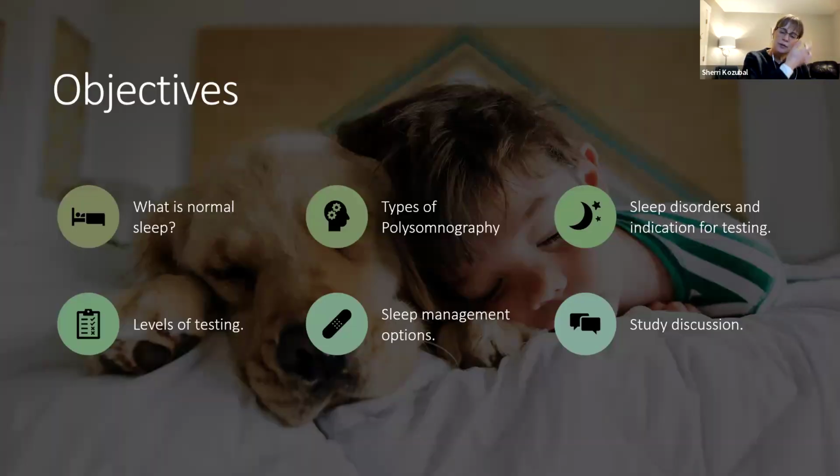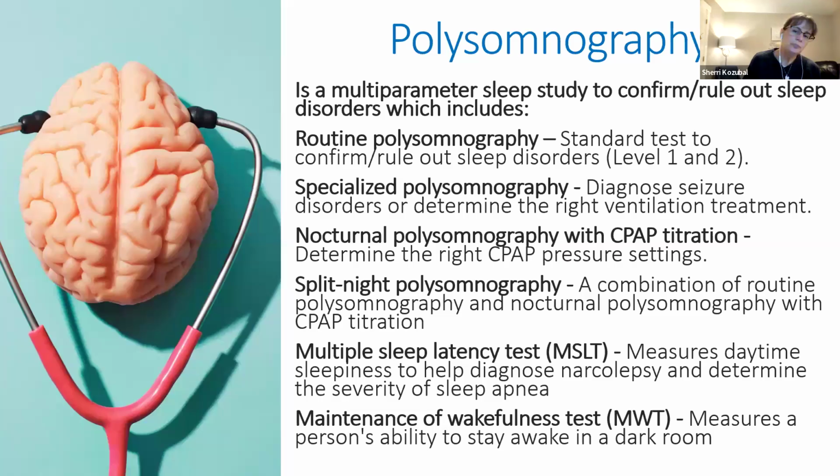So the objectives of this webinar today, basically, I want to go over what is normal sleep, what's polysomnography, different types of polysomnography, different levels of testing, sleep management options, sleep disorders and indications for testing, and then as well some study discussion.